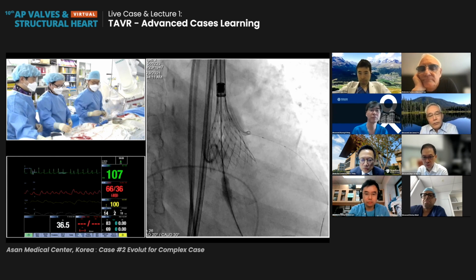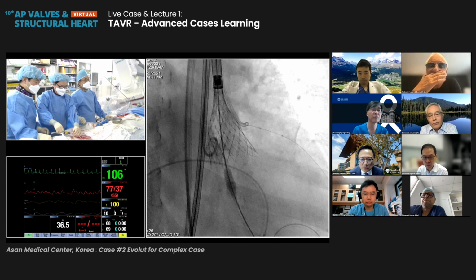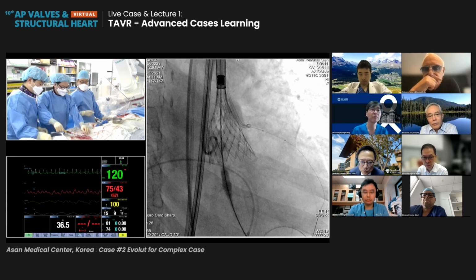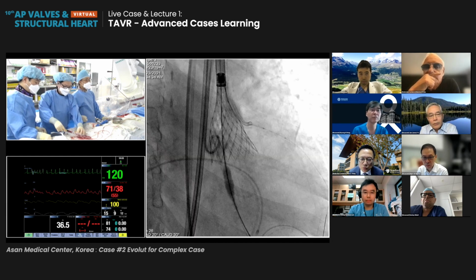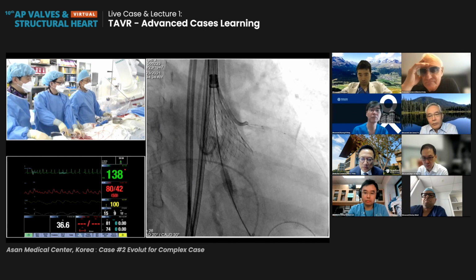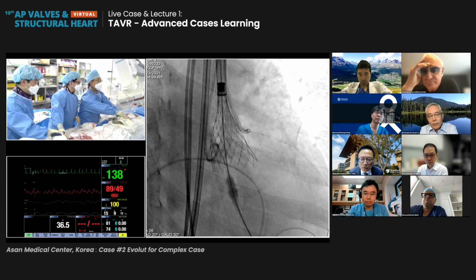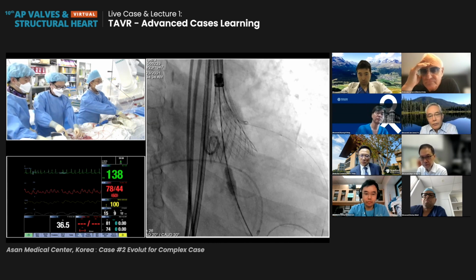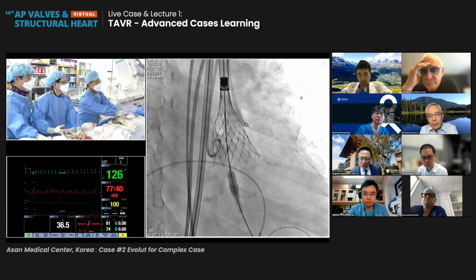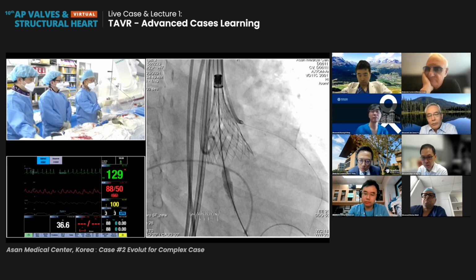오케이, 이 코로나리 한번 살짝 찍어볼까요? obstruction 리스크 어떤지 보게. Okay. So, this patient's concern is not PPI. This is coronary obstruction is major concern. Okay, test. Okay, coronary obstruction looks okay. 이거지? 잠깐만. 자, 여기서 한번 찍어볼게. coronary obstruction. 자, 준비됐지? 네, 됐습니다. 자, 풀샷. You know, so as you see, the coronary ostium is okay.